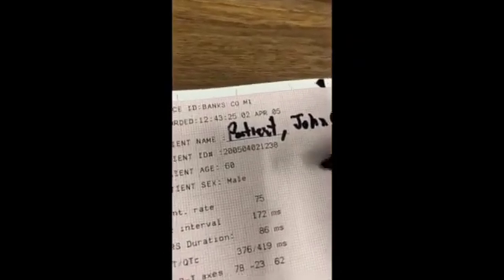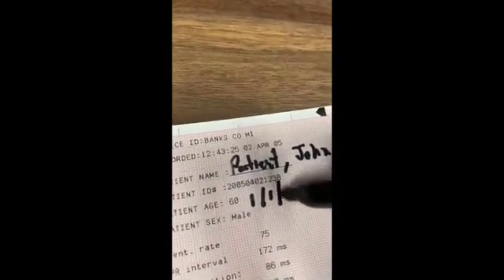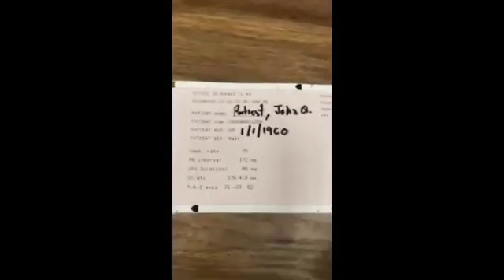2. Write the patient's name on the patient name line, as well as their date of birth next to their age on the patient data page. Also write the patient's name on the appropriate line at the top of the lead tracing pages.